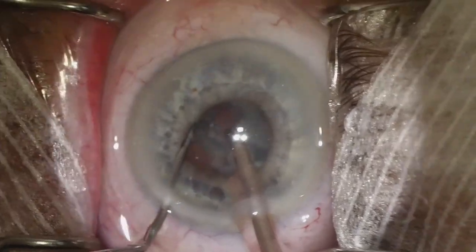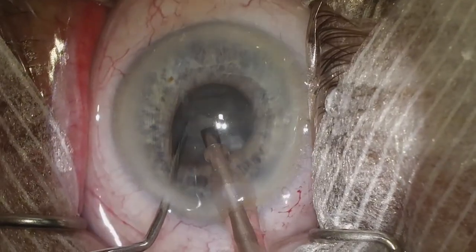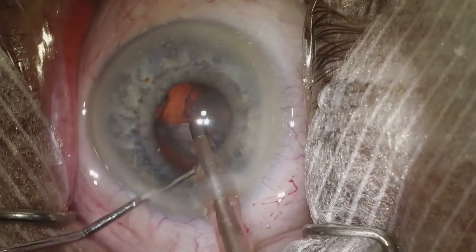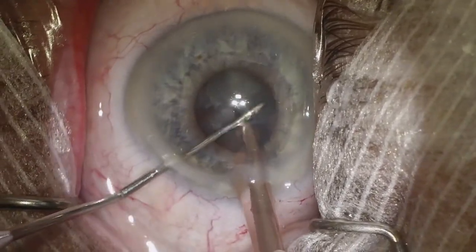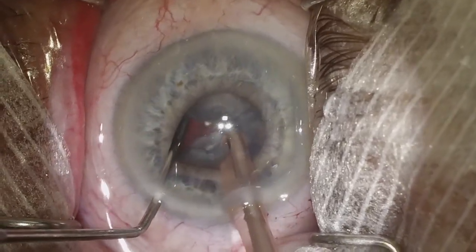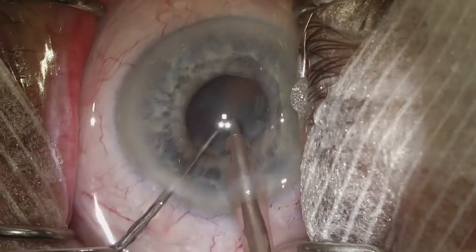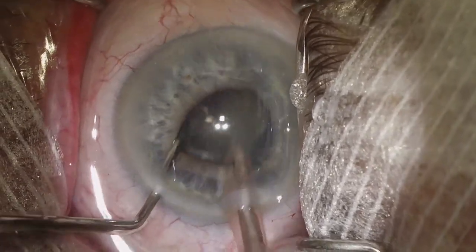Here we're attempting to take out our first quadrant. This is an unedited video — I just made a note to myself that it was relatively good quality. So we've removed one quadrant, and now we're going to try and remove the second quadrant. We separate it out and make sure we've got a good crack and separation so the piece can be pulled into the iris plane or the anterior chamber. If we're having trouble we can always use our second instrument to pull that piece up. You can see that the iris does limit us a little bit as far as the piece being able to roll and tumble as we do phaco.